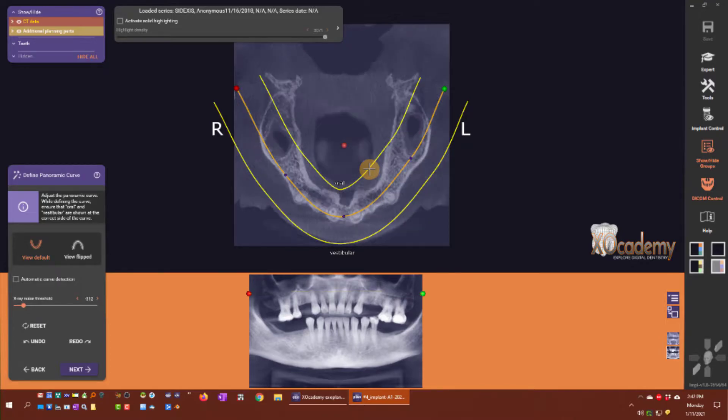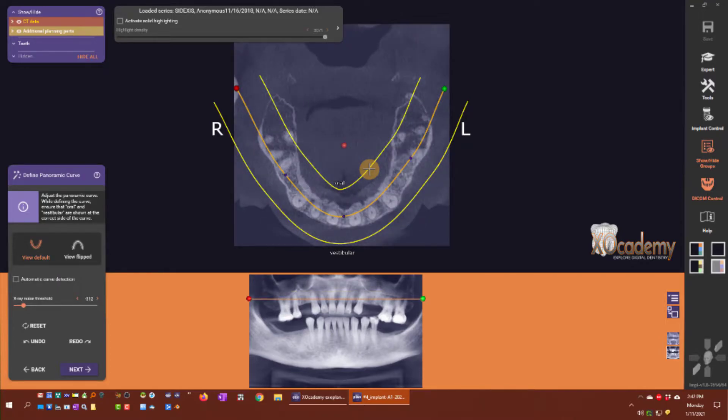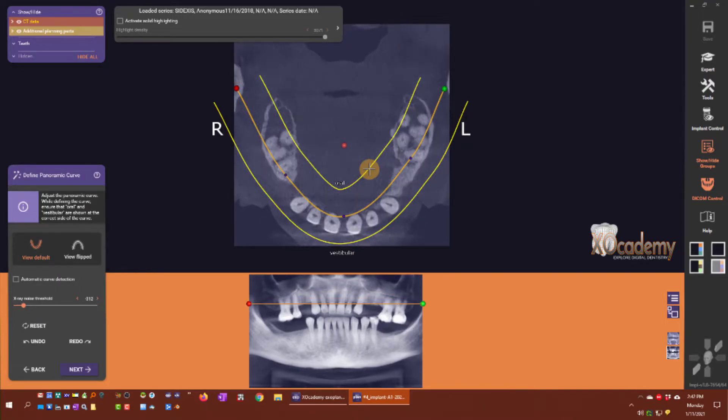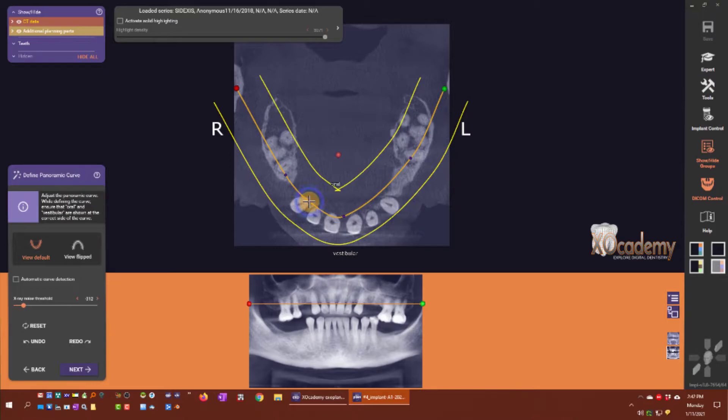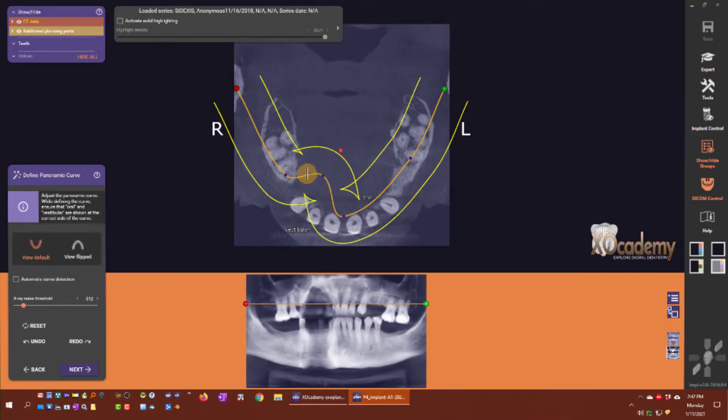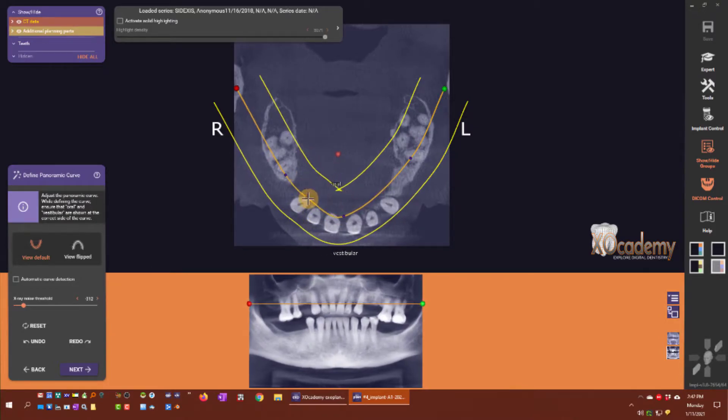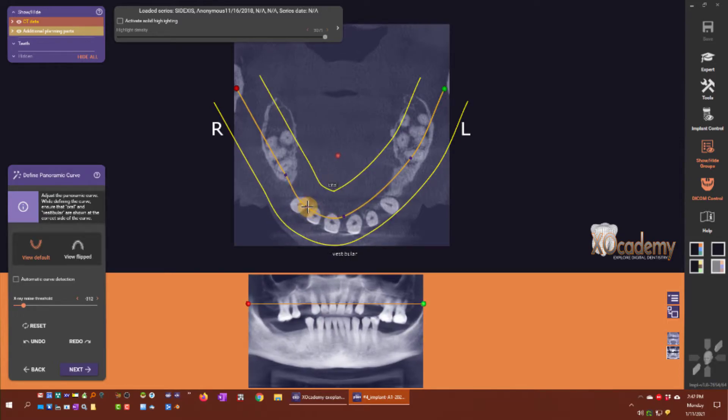If this is an acceptable curve, we can just click next. If we want to add more points to this curve, I simply click on the middle anywhere of the orange line to add a control point and move that curve around.